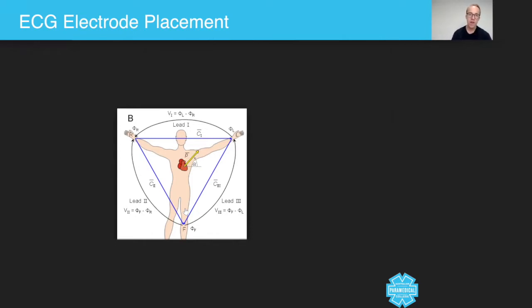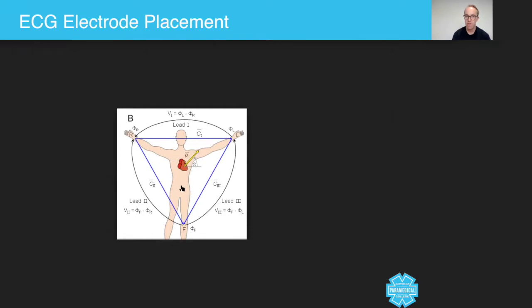So this thing here is called the Eindhoven's triangle. And the idea is that any way you place these ECG dots, the electrodes, it's going to pick up the electrical activity from the heart within this triangle.